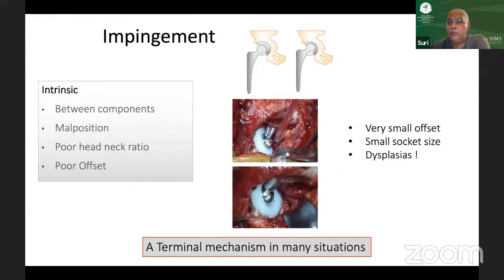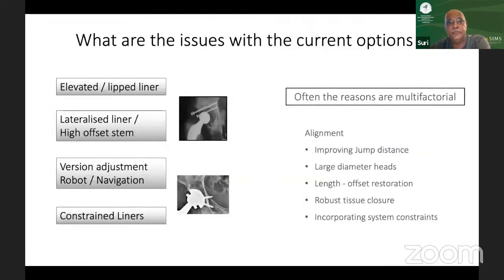This is also certainly important in small women and small anatomies we treat quite often, with very small acetabular cup sizes and dysplasias. Another red flag area where one should be very exacting in terms of combined anteversion, cup inclination, offsets, everything. The smaller the offset, the greater the danger. That's where the smallness of the patient, or the patient profile, comes into view.